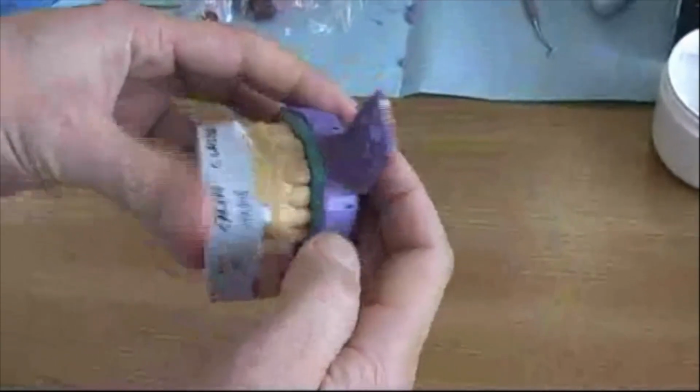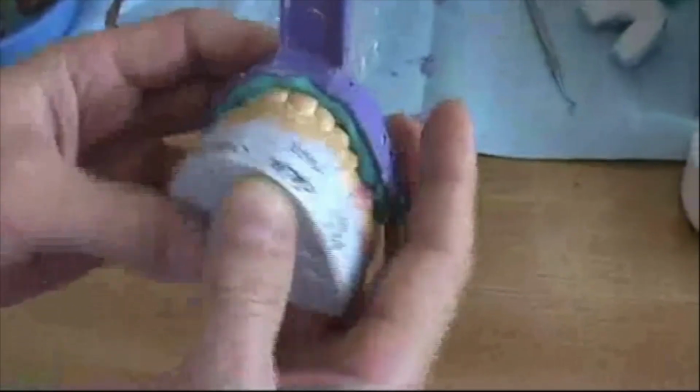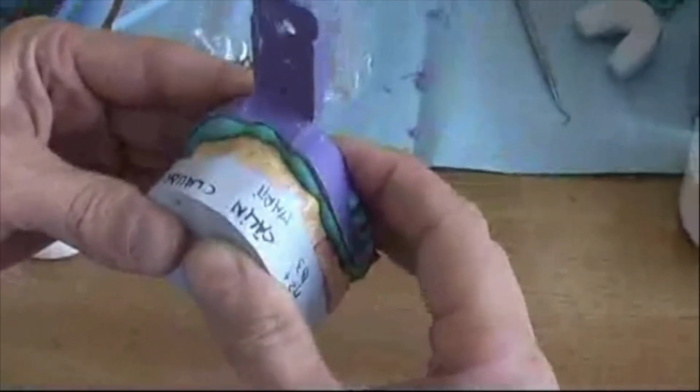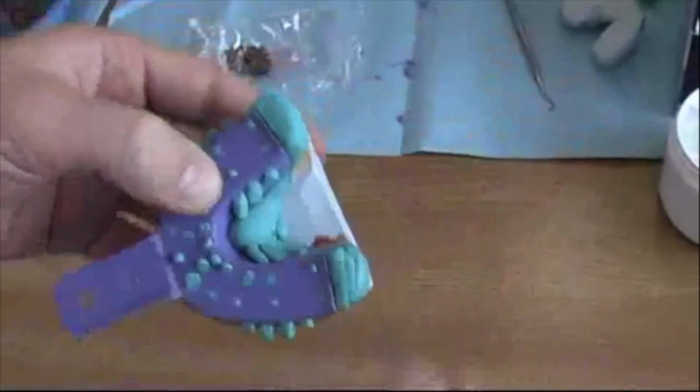And now you place the impression tray, not from back to front, but straight on, like an elevator, like a lift that goes up. Whoop, slowly. One move, one shot. Don't put too much pressure. Or if you do, then release the pressure. Okay.